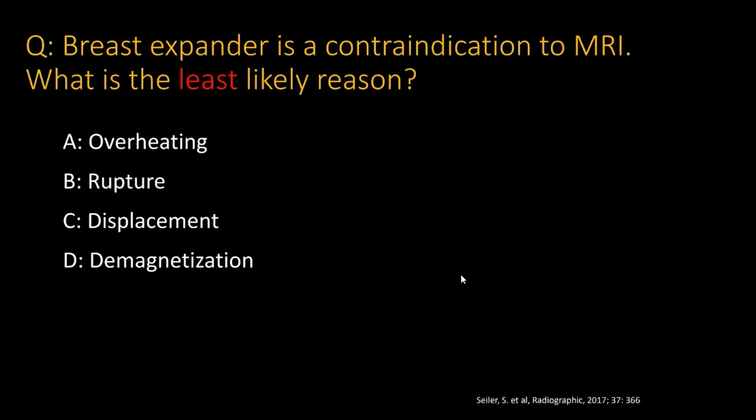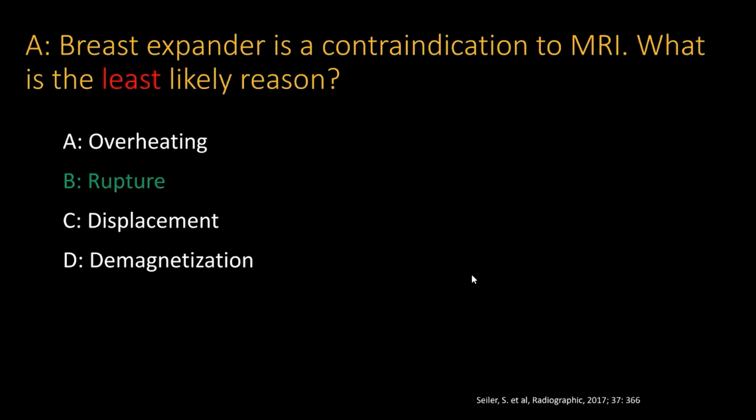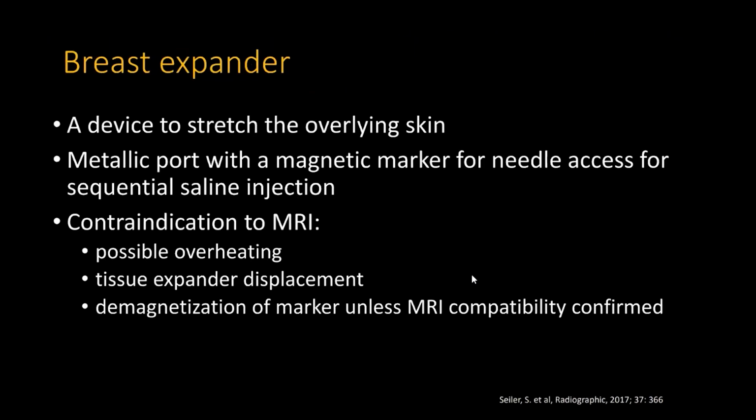Okay, another question. Breast expander is a contraindication to MRI. What's the least likely reason? All right, all of you got it right. Let's review the breast expander.